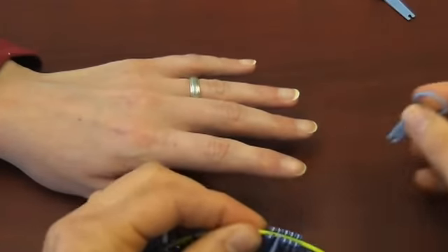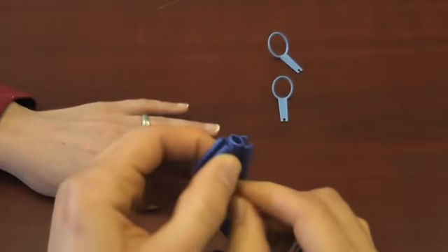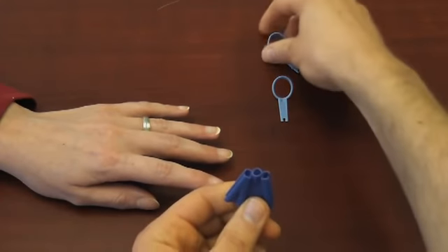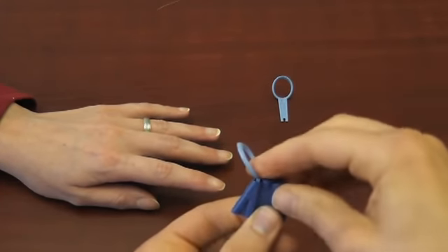To make a trial splint, insert the tabs of the rings you have chosen, so the rings face away from each other. If you are unable to insert the tabs all the way to the base of the holder, the holder may be upside down.